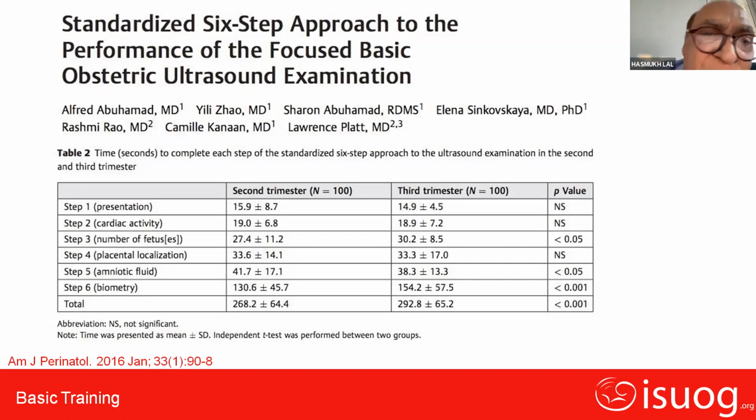You should see him performing a scan. I believe that in 9.5 minutes he will complete the whole anatomy scan. Maybe we will be lucky at the conference when he is demonstrating. So the first thing, as I said, is to keep the transducer perpendicular. Don't tilt it, don't angle it. You can angle it at the symphysis pubis to look at the head, whether the head is there or not.